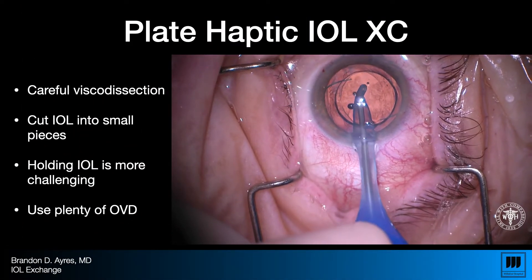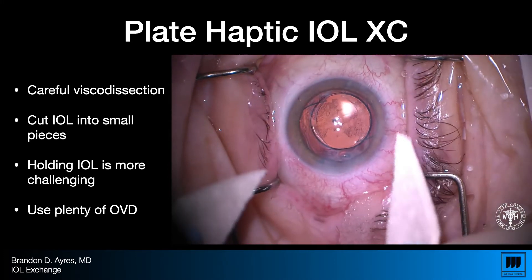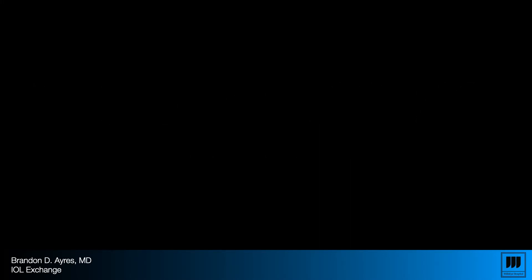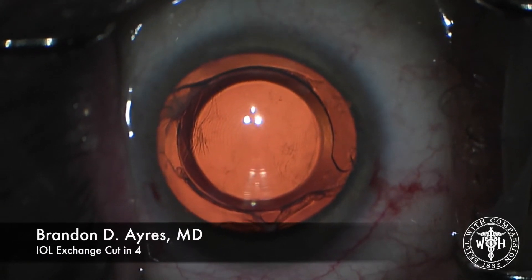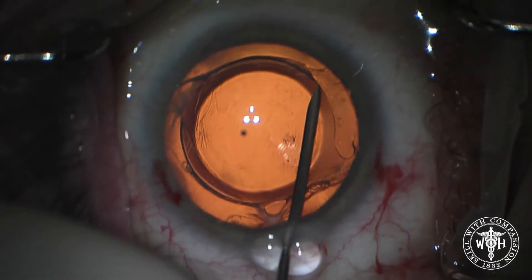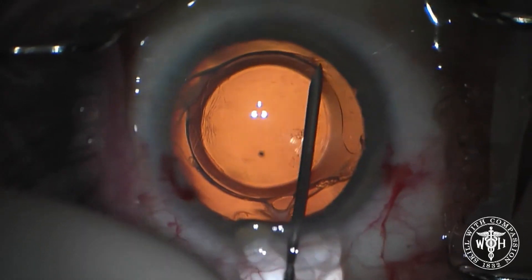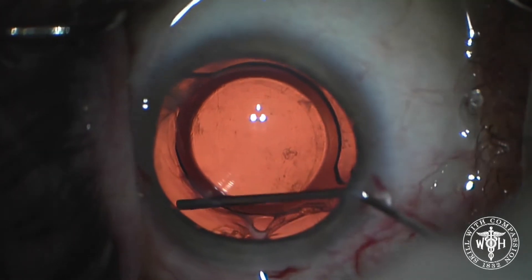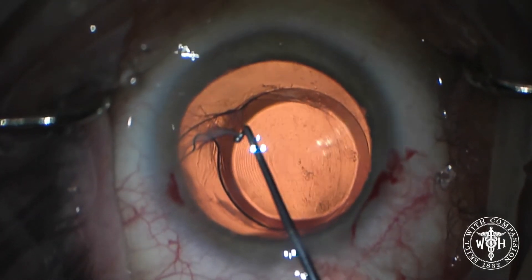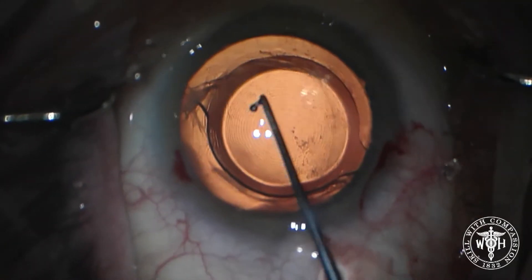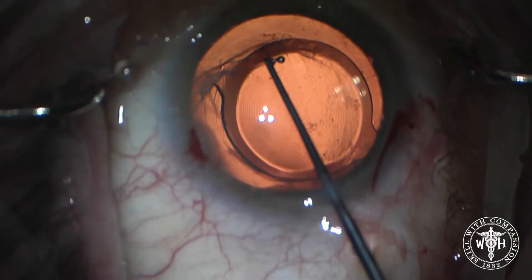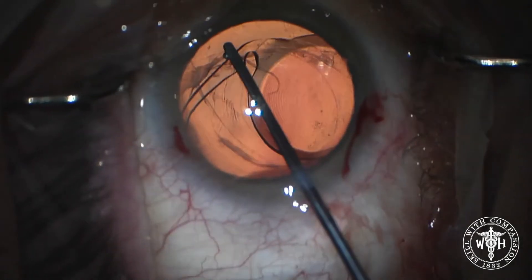My preference is to traumatize the wound as little as possible. Here you'll see an upside-down 25-gauge needle on viscoelastic — let that viscoelastic egress and don't over-pressurize the eye. You can see the anterior and posterior leaflets open with a little bit of fibrosis. On the Johnson & Johnson platform, the most adherent section of the lens is right at the haptic-optic junction where that little cutout is. On the Alcon platform, the most challenging portion to dissect is the more distal terminal bulb on the haptic.